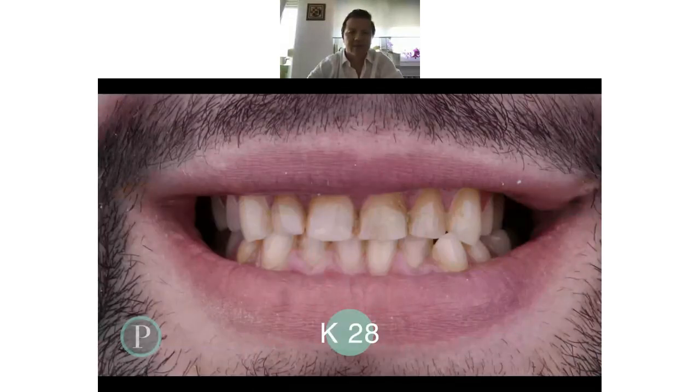This is the case which I'll show you today. It will be a combination between these two approaches. Why do I say combination? Everything you will see was done digitally, but for example, we did the wax-up the analog way. This is how we mostly work now. We have produced some good cases in totally digital form, where there was no tray or anything else in the patient's mouth instead of the scanner. But mostly now we are doing it this way.